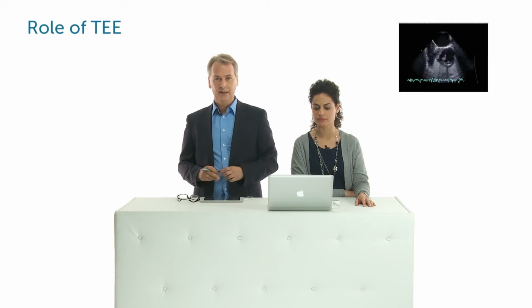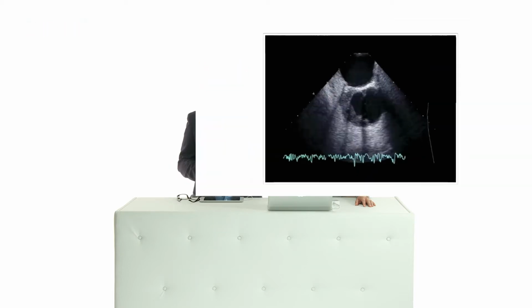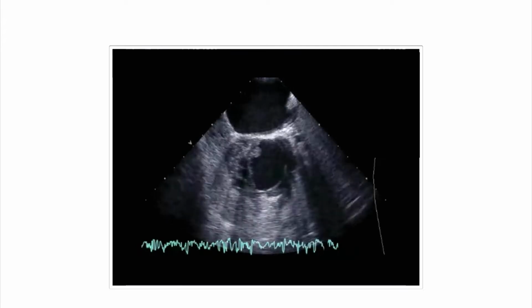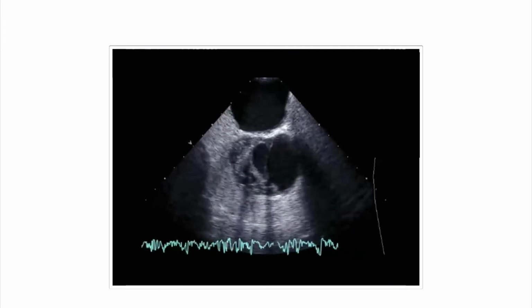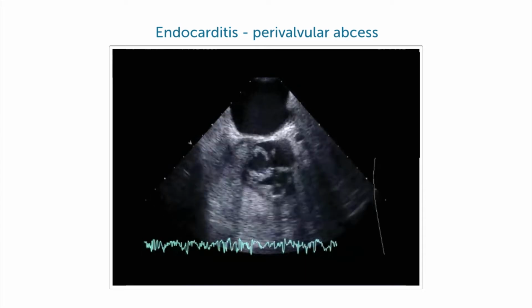For example, in this case here, it's quite simple to see AR, but sometimes information is hidden. And sometimes we will need additional imaging modalities, for example, transesophageal echocardiography. And this is the same patient now. Look what happened in this patient. Well, he has a bicuspid valve, but not only that, there seems to be a massive infection on the aortic valve. So the key message here is, in most cases, yes, transthoracic echo, but sometimes you also need a TEE study.